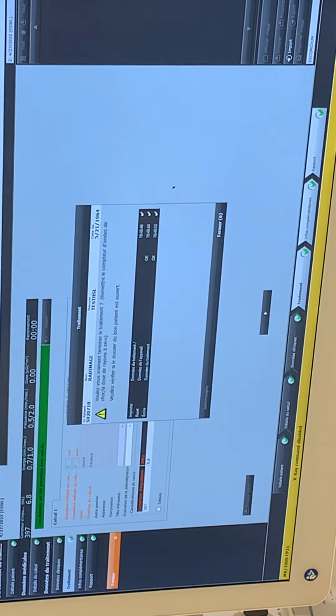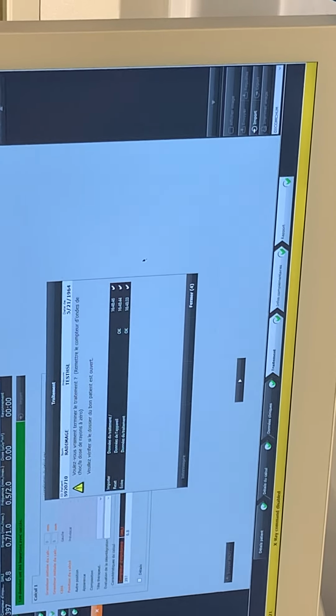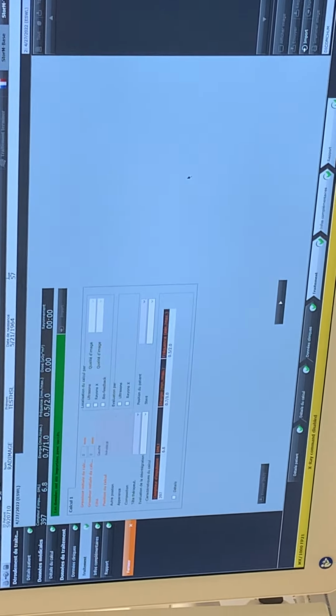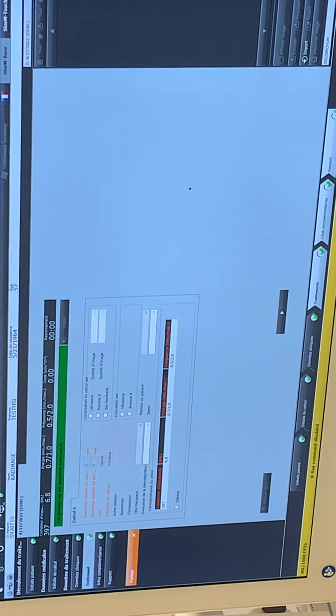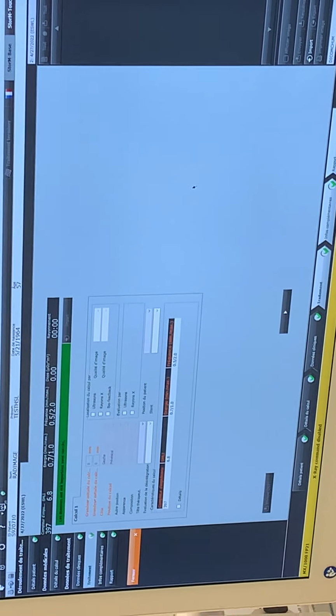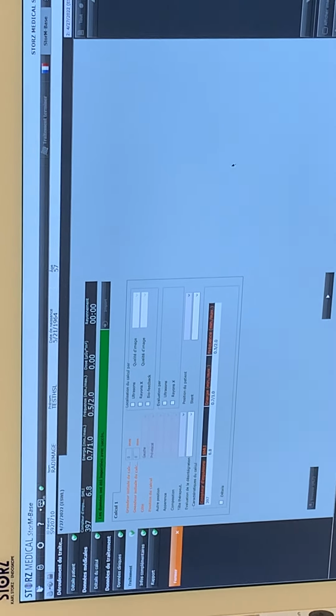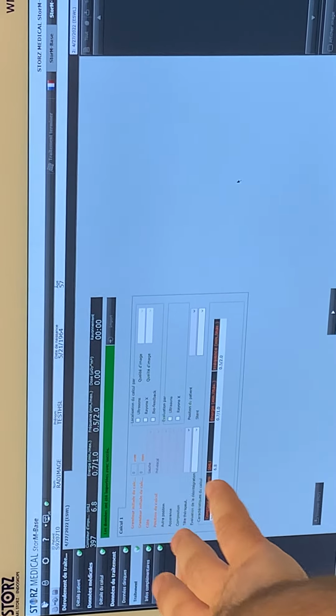Okay? So I have to come back here. Yes. Because you will come back here and the technician can go to the table and lower everything. Now you are done. The technician can go to the table, use the automatic movement to bring down the patient, and now you can work on the database.